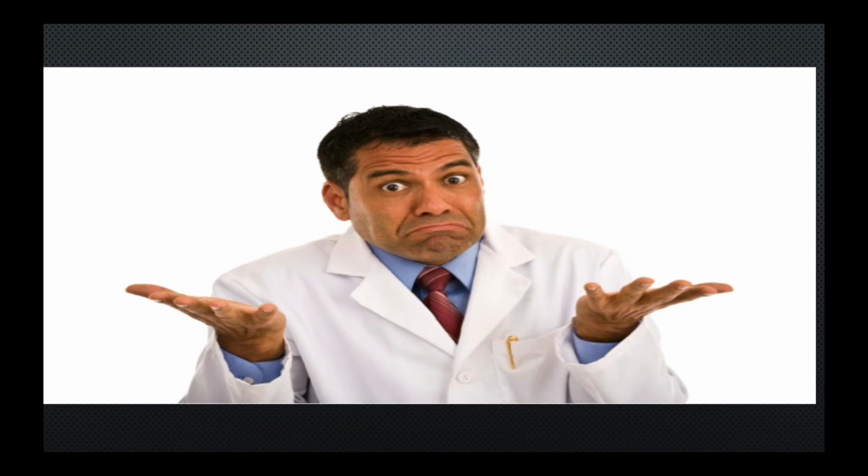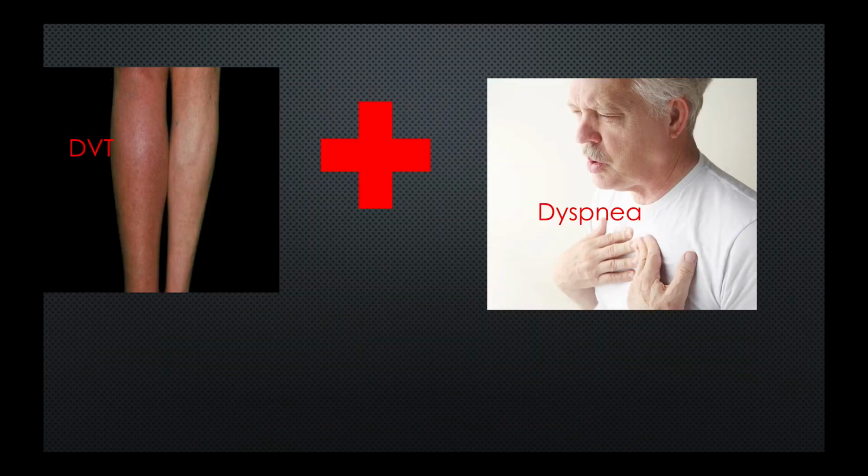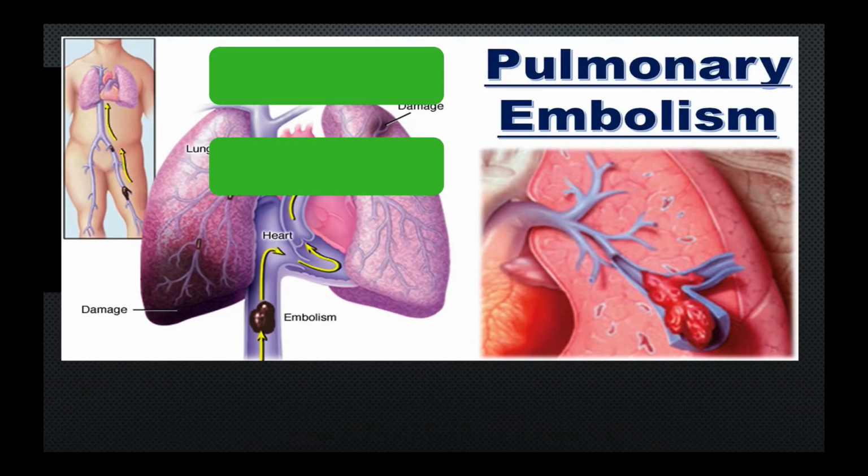If your patients are having surgery, seeing you in follow-up clinic, coming to your office with a history of cancer, have leg pain and/or shortness of breath, the visualization of DVT with concern for PE can diagnose that condition and potentially avoid radiation from angiography.